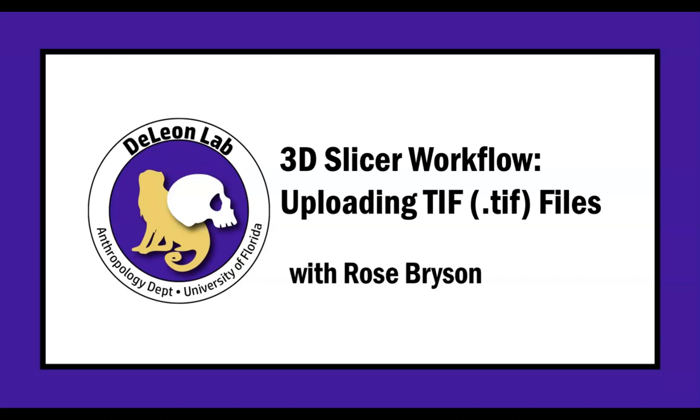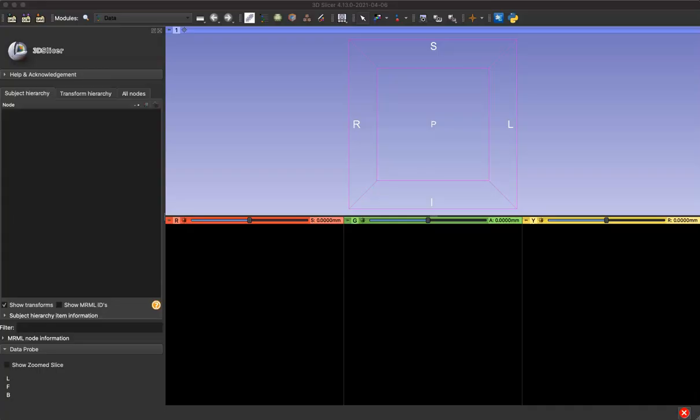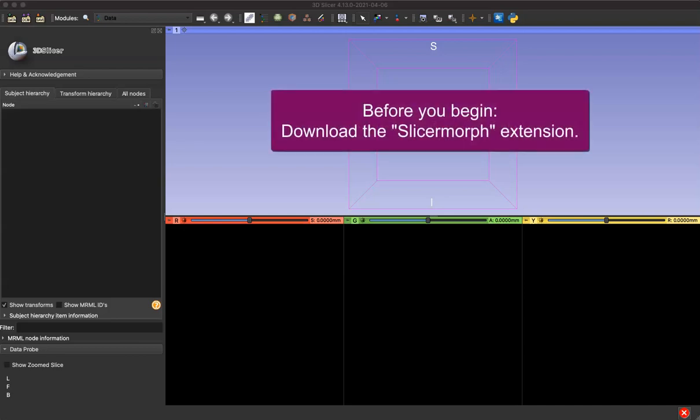Hello and welcome to our quick tutorial video on how to upload TIFF files into the Slicer application. There are multiple ways to load data into your Slicer app, so this is just the way that I upload data if it's in a TIFF format.